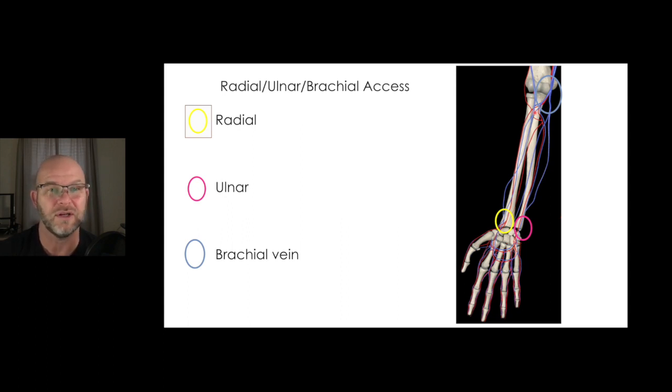There's more stimulation in my opinion, because when you go through the leg, all they do is numb it, and then you'll feel the pressure of the sheath going in. Remember, the numbing medicine takes away the sharp sensation, but can't take away touch. Here, your radial or ulnar gives you good options for your arterial approach, and brachial is a good option for a right heart cath. Usually, flow in the hand is assessed. You want to make sure it's a good radial with backup flow to make sure that hand is safe if there was a problem with that artery stick.